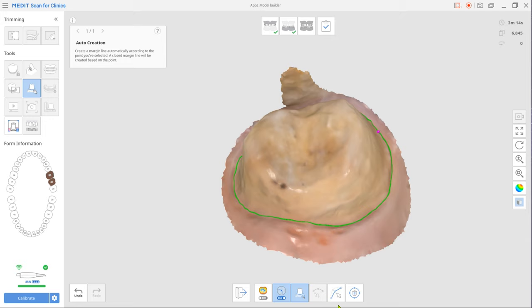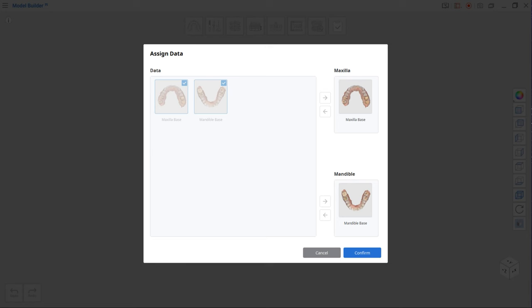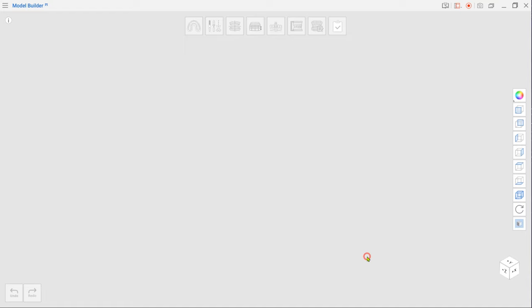After scanning, open Model Builder by clicking the app icon at the top. Your scan data will be automatically assigned as maxilla and mandible.